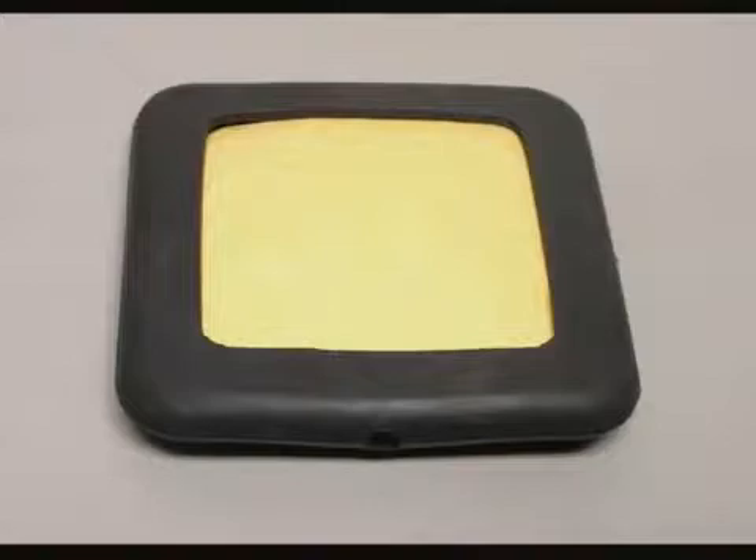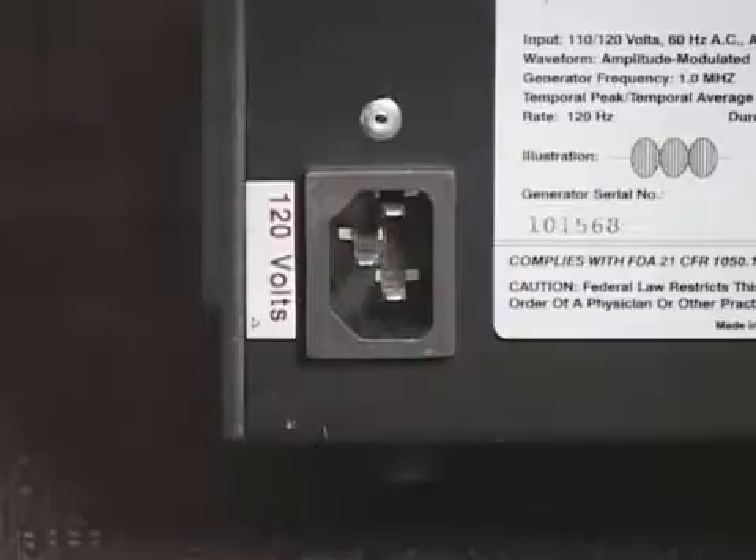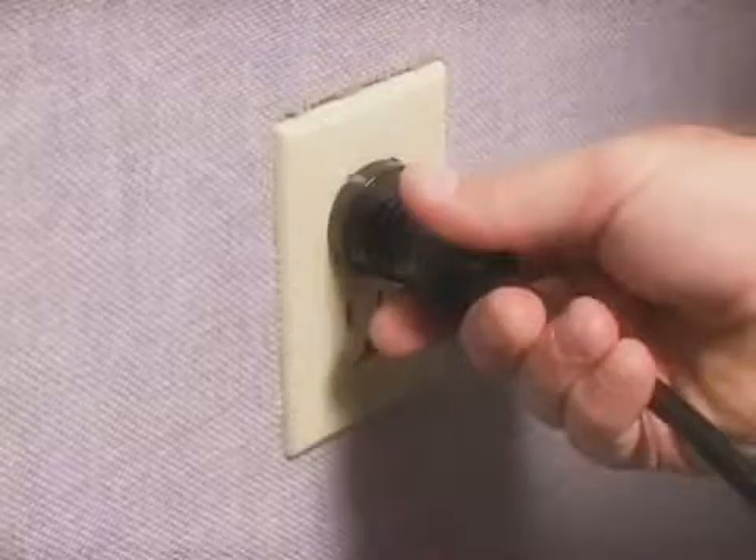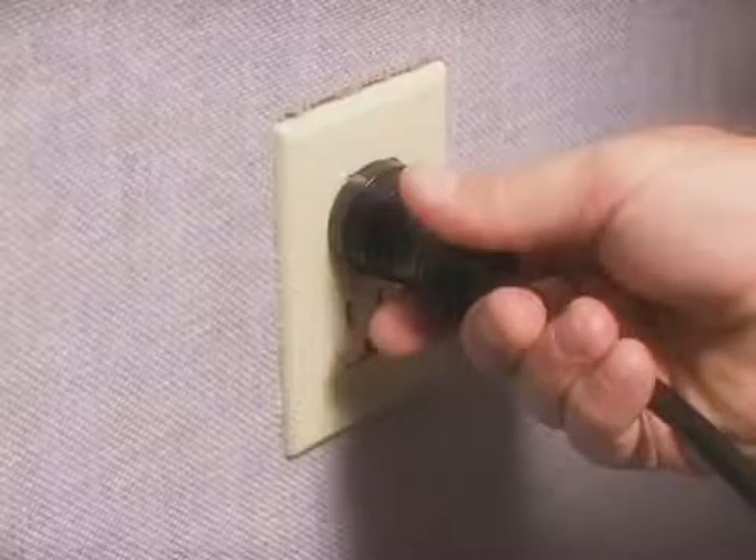Thoroughly moisten the treatment site and electrode surface prior to every treatment. To operate model LVG325A, first connect the power cord to the AC receptacle on the back of the unit and insert the power cord plug into a properly grounded AC receptacle.